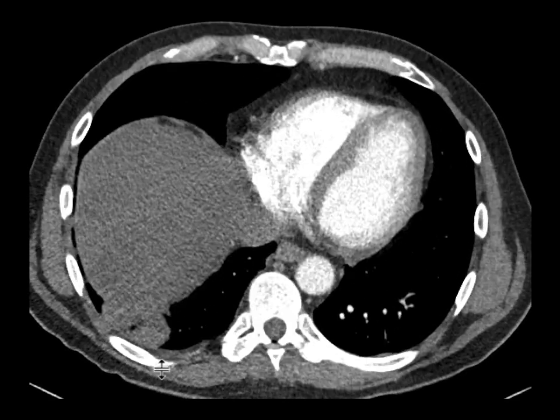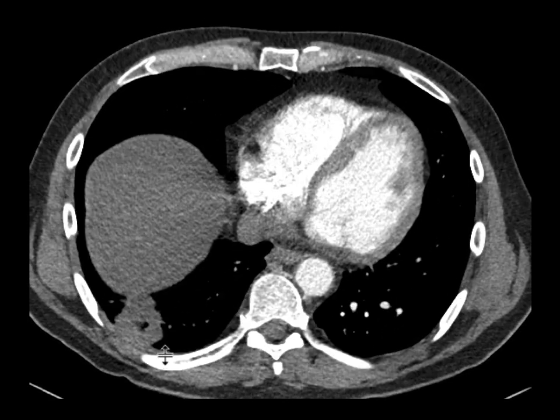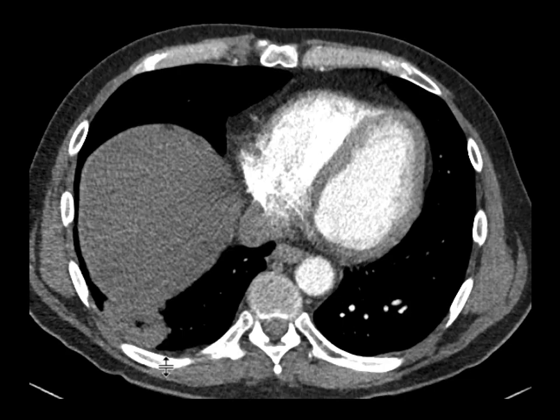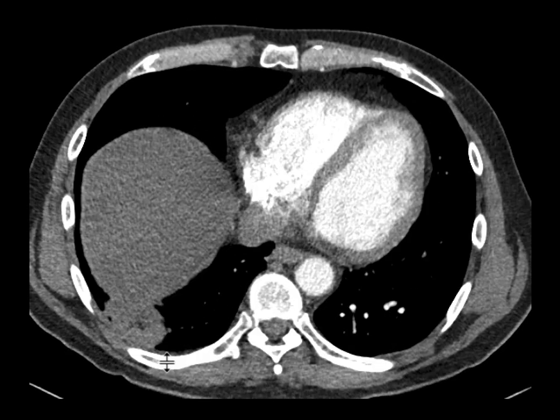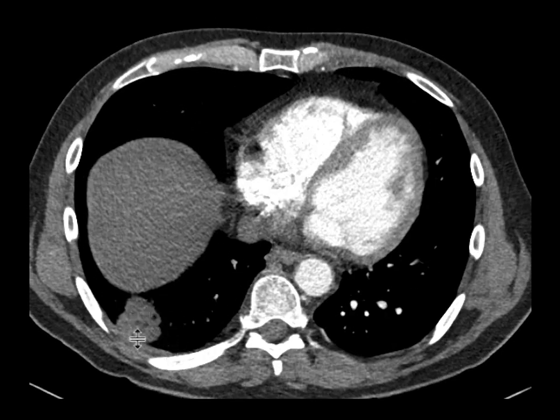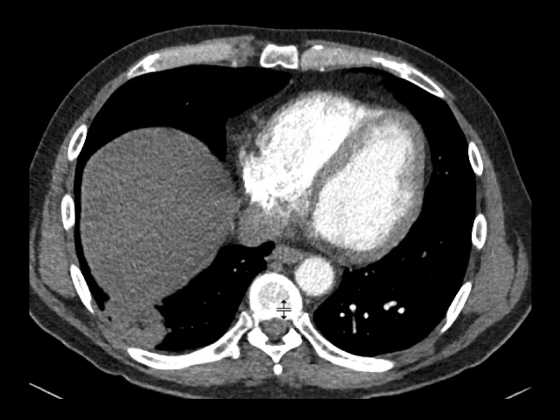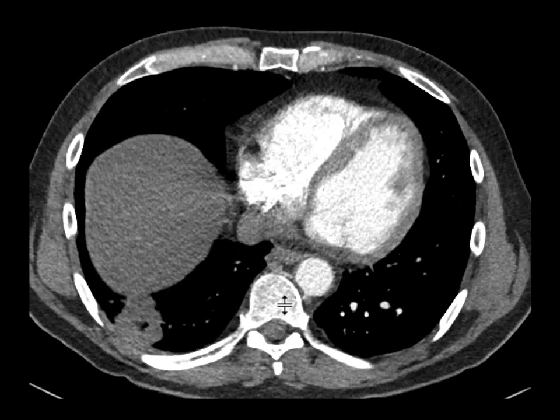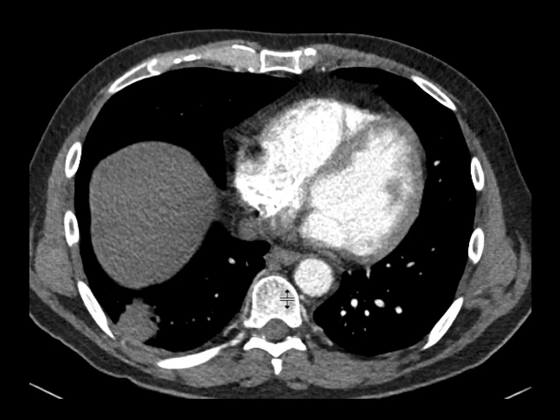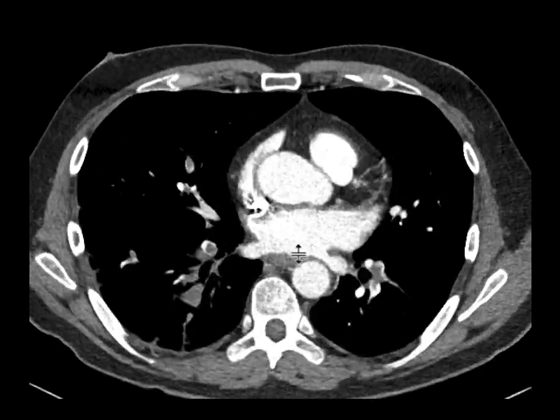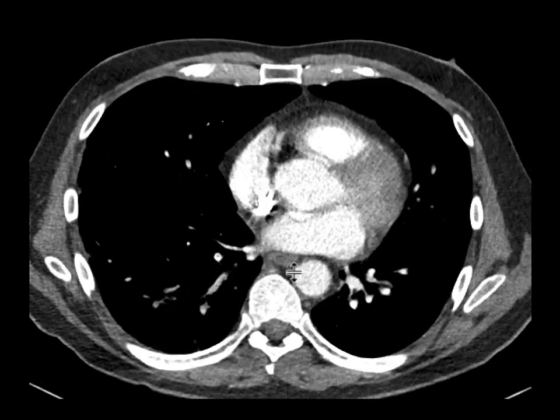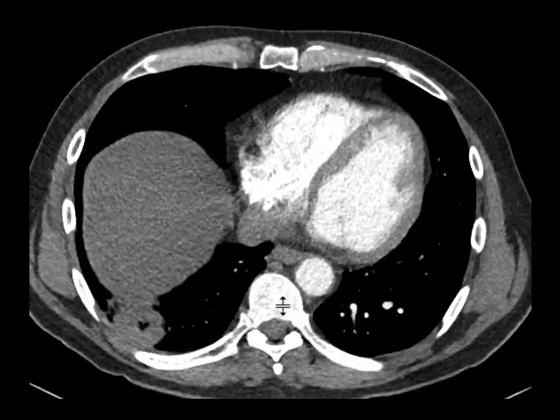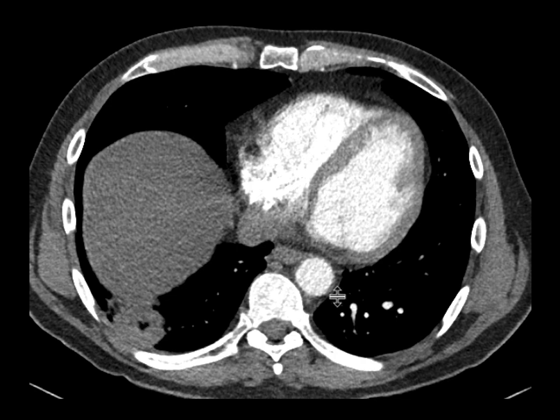We see pulmonary emboli from time to time — it's not an uncommon diagnosis — but this finding here is compatible with an infarct, something which we don't quite see that often associated with PE. In this instance, we see a nice example of a pulmonary infarct.